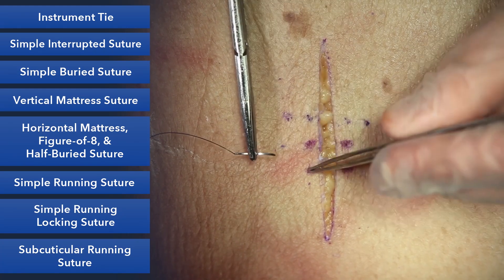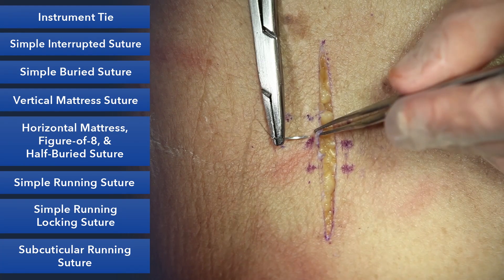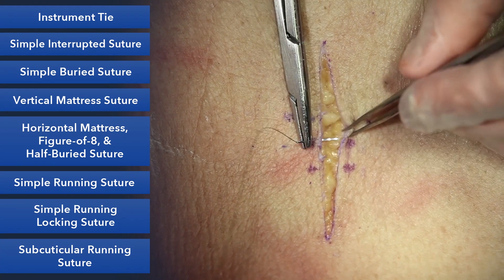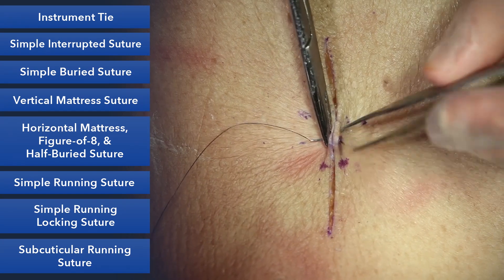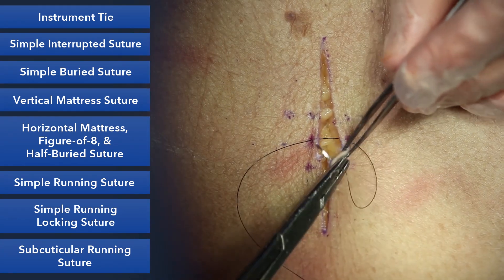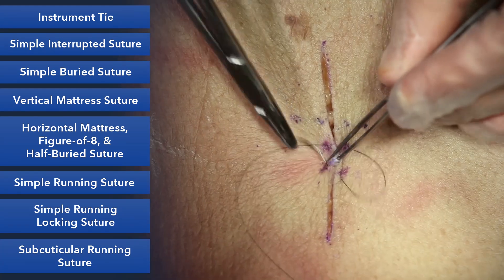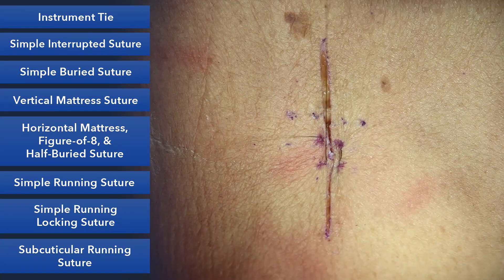It's important here that you stay close to the skin edge and you're the same distance on both sides. You'll take your bite on one side and then the other side, and then you'll turn it around and go back so you end up on the same side. And there you can see our mattress.